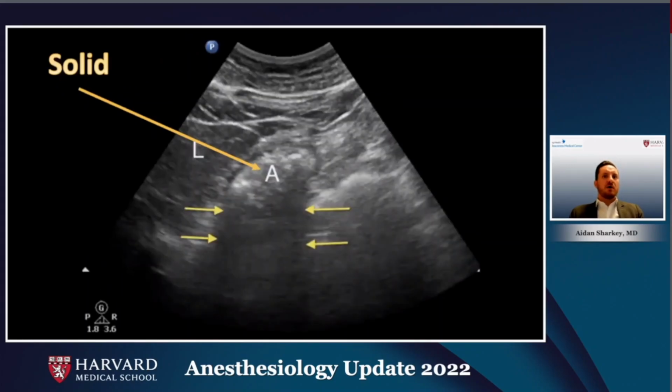Chewing and swallowing of solid matter are invariably associated with the ingestion of air, as stated before. In the early stages after solid consumption, this air prevents sonographic visualization of deeper structures and creates what is called the frosted glass appearance. No structures deep to the anterior wall of the antrum are seen, as demonstrated in this image where we see the frosted glass appearance.